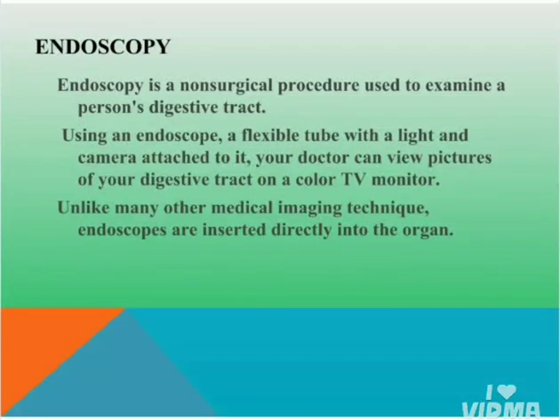Hello all, today we are going to discuss endoscopy. Endoscopy is a non-surgical procedure used to examine a person's digestive tract. Using an endoscope, a flexible tube with a light and camera attached to it, a doctor can view pictures of the digestive tract on a color TV monitor.